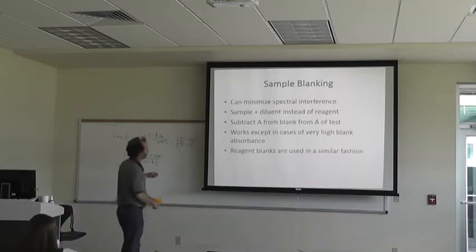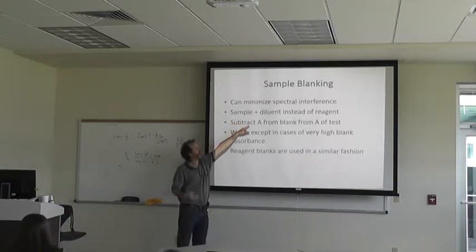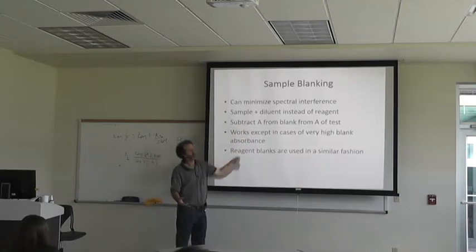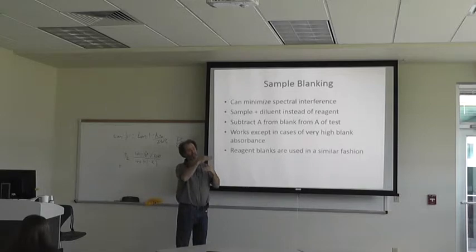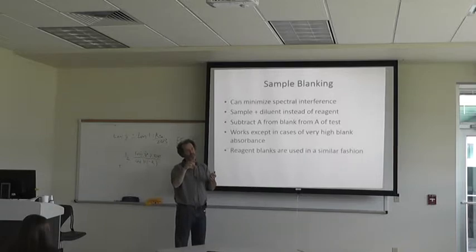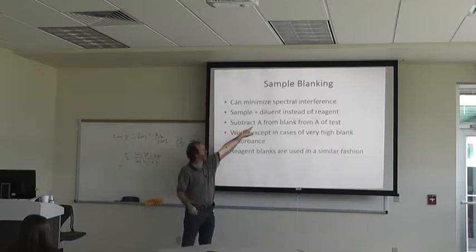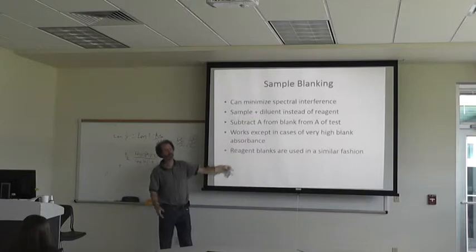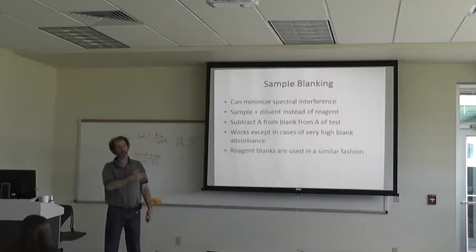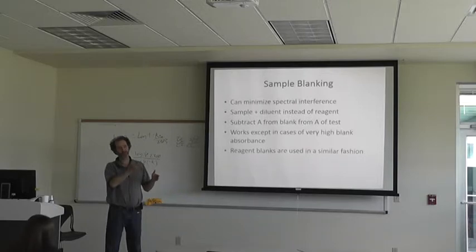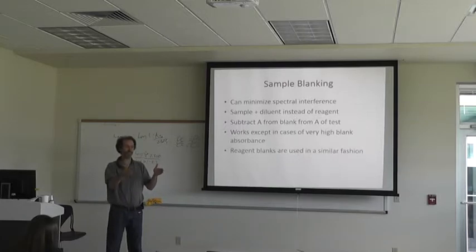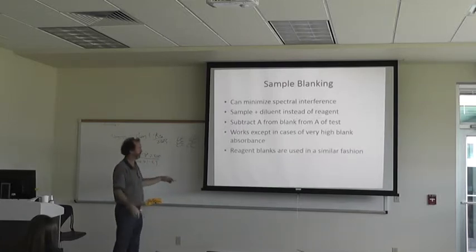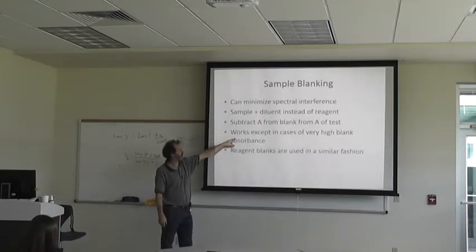Sample blanking can minimize spectral interference. You use the sample plus a diluent instead of the reagent, making sure that the blank contains the exact same matrix as the sample. The only difference should be the analyte itself, and you subtract the blank absorbance from the test absorbance. This works except in cases of very high blank absorbance — if you have really high blank absorbance, that decreases your sensitivity because you have much more error built in.